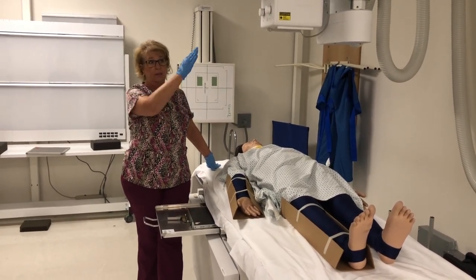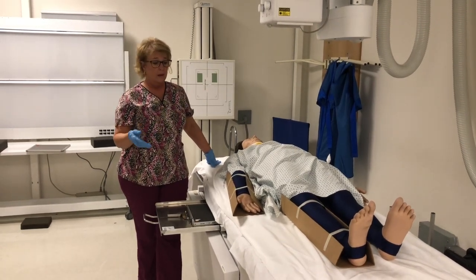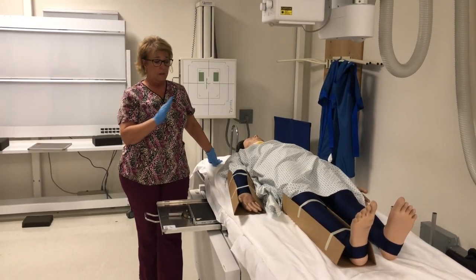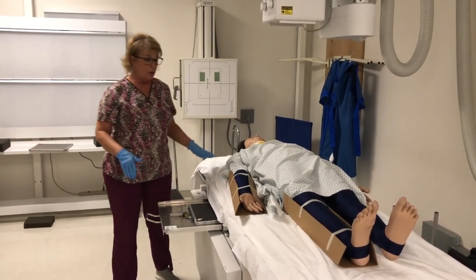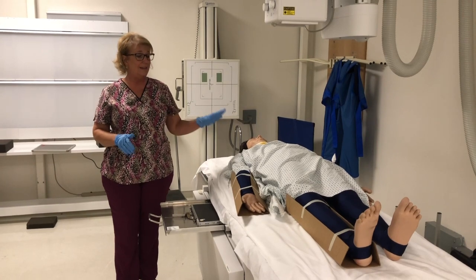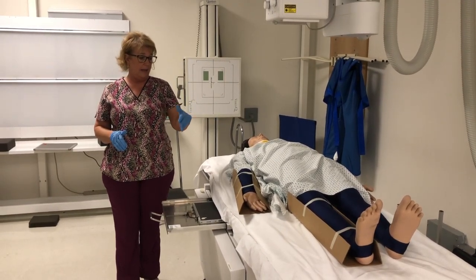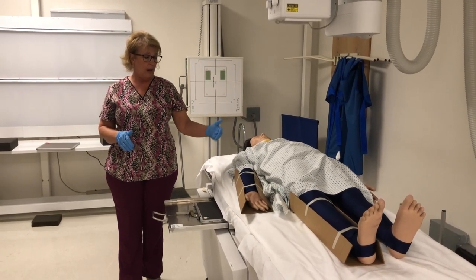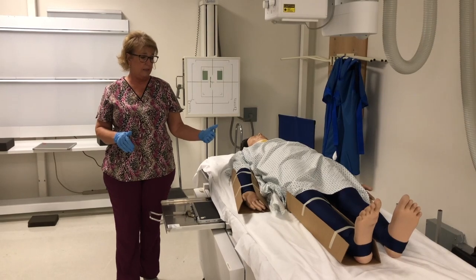That way you're not moving the tube back and forth, you're not moving the patient back and forth, you're keeping their comfort and your efficiency in mind. So we're going to assume that this patient has a CT and L spine, a right lower leg, and a right forearm. So those are the positions I'm going to be demonstrating today.